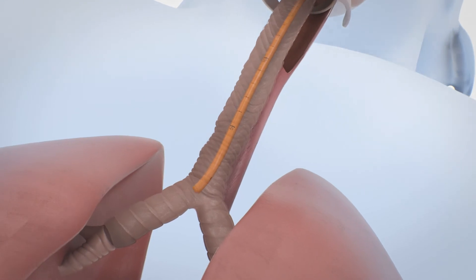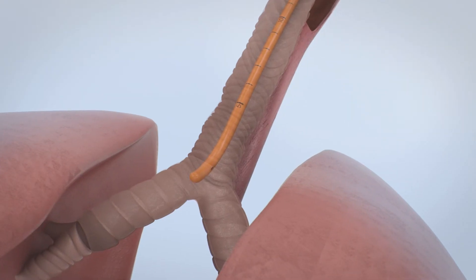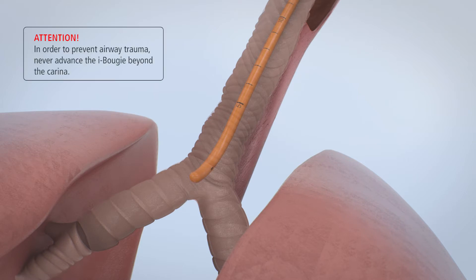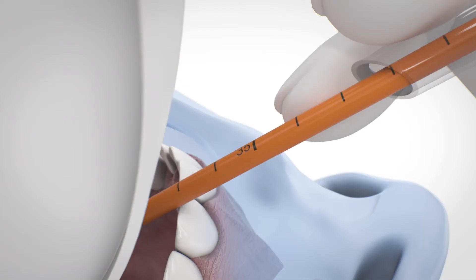If a holdup is felt at the 30-35 cm marking, then the tip of the EyeBougie reached the carina. Attention! In order to prevent airway trauma, never advance the EyeBougie beyond the carina. In this case, withdraw the EyeBougie to the 25 cm marking.